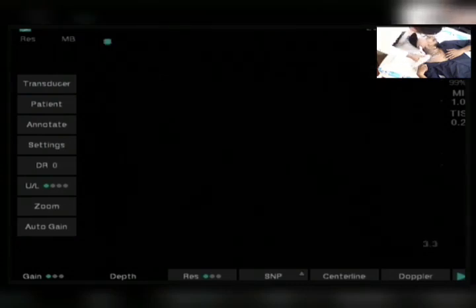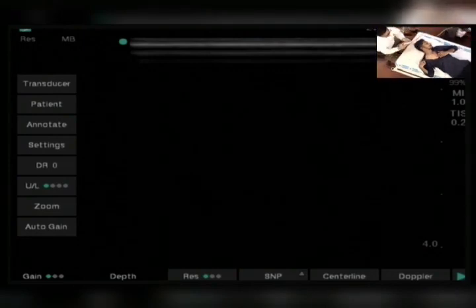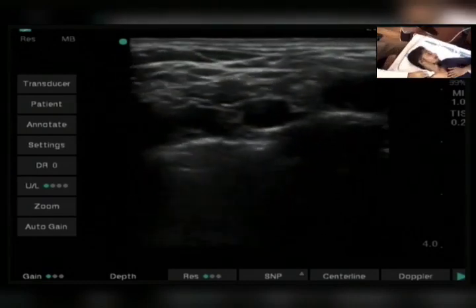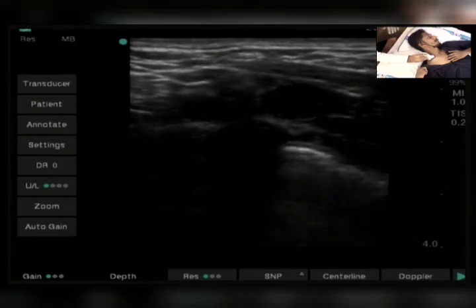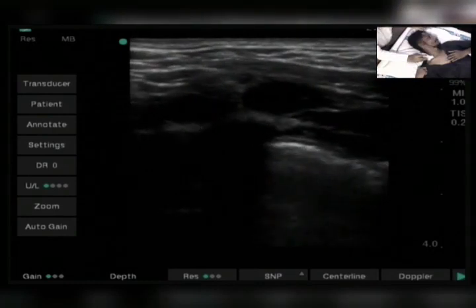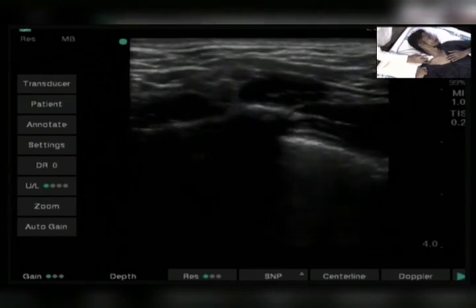First of all, you want to see T2. So make it ergonomic, because many times I have backache and all. How I utilize the probe is that I keep the probe marker over here on the same side. This is the probe marker, and somewhere here I keep the probe marker. So it is based on my preference. There is no thumb rule, I think. So we can reduce the depth.